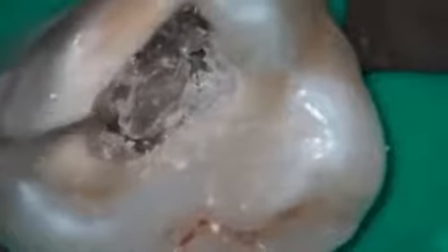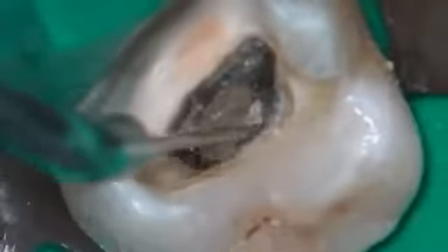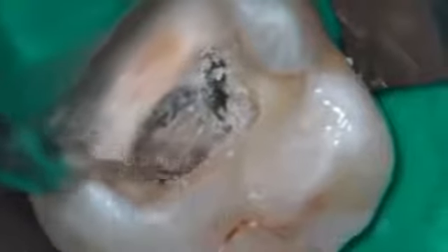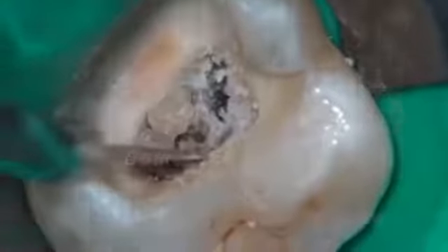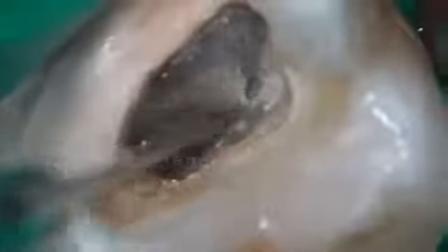The voluminous pulp stone occupying the chamber was dislodged and removed, and the pulp chamber debrided.